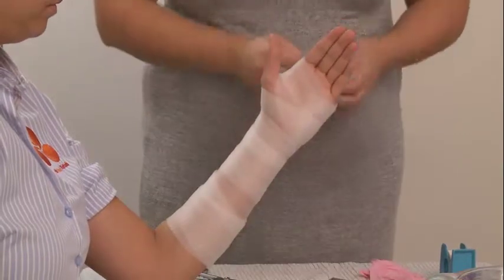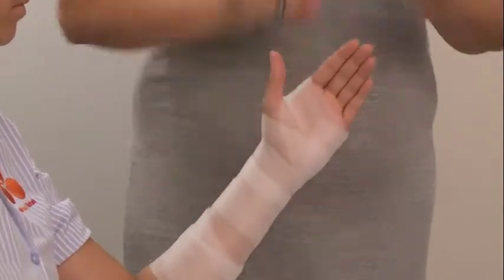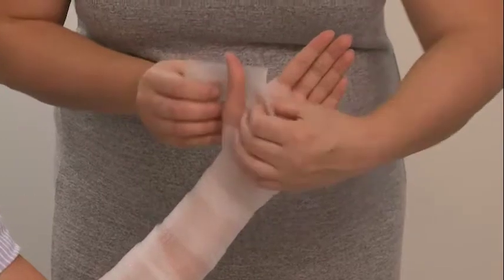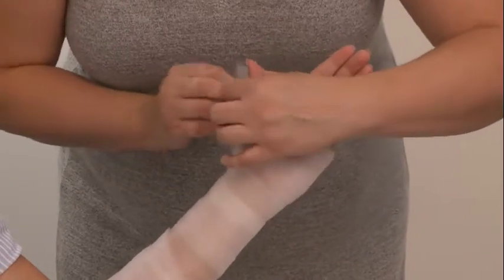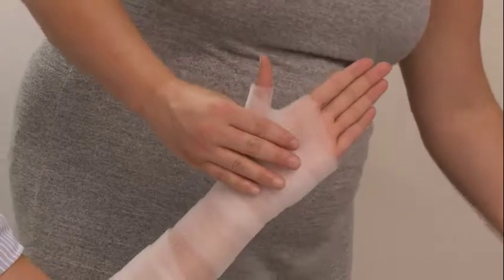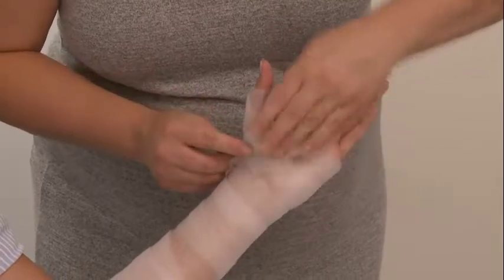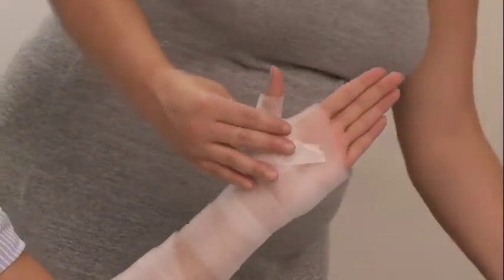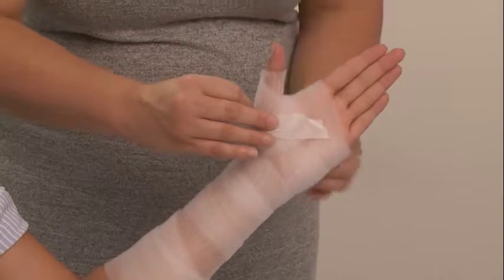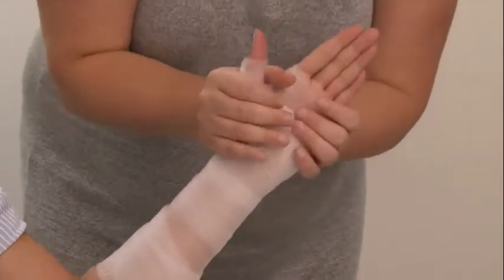I'm just going to secure the end with some micropore. For the thumb component, I'm cutting a piece about ten centimeters, and in the middle of that I'm making an incision leaving about two to three centimeters. This is going to minimize bulk through the web, and then we're just wrapping it around the thumb. That incision goes in the web space, and you'll secure that with a bit of micropore — again just to eliminate too much gapping or bulking. You want to contour it as much as you can with the waterproof padding.